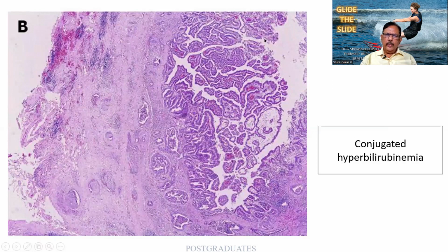So, what we are seeing over here is again a tumor. It is infiltrating the walls, and within the lumen, I am able to find a fine arboriform pattern. There are some well demarcated glands also that can be seen. The wall is showing a reactive desmoplastic reaction along with probably some bacterial colonies and inflammatory infiltrate. I do not know what those are at this magnification.